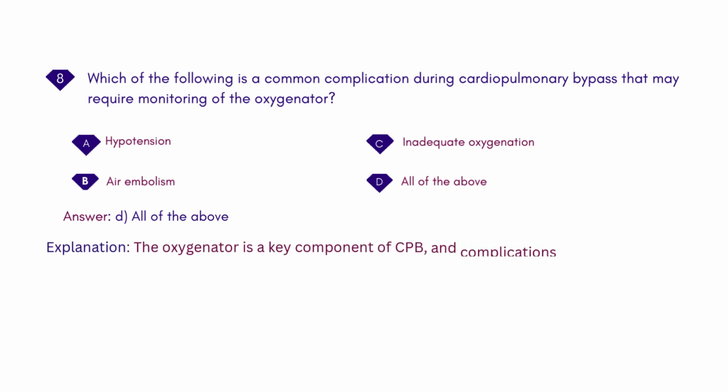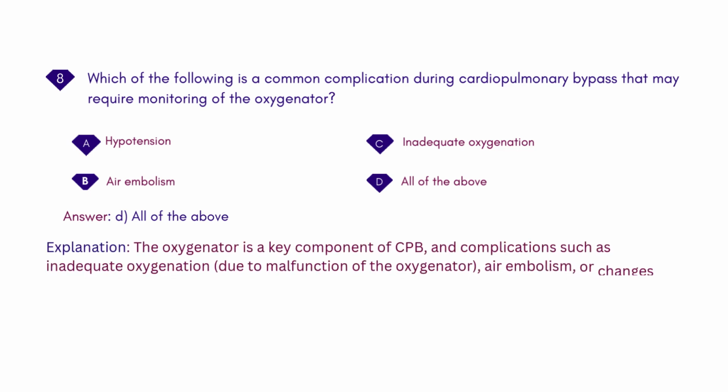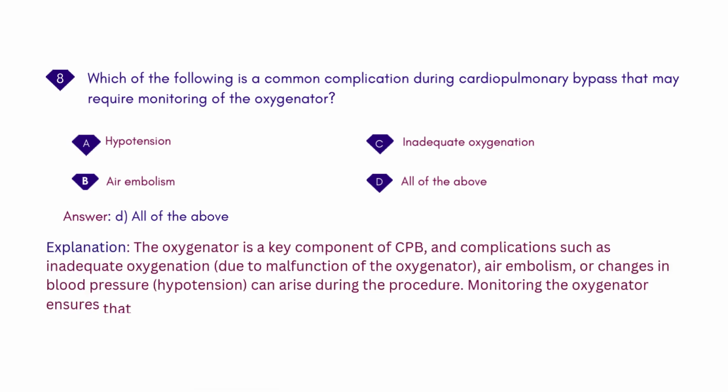Explanation: the oxygenator is a key component of CPB, and complications such as inadequate oxygenation, due to malfunction of the oxygenator, air embolism, or changes in blood pressure, hypotension, can arise during the procedure. Monitoring the oxygenator ensures that it is functioning properly.